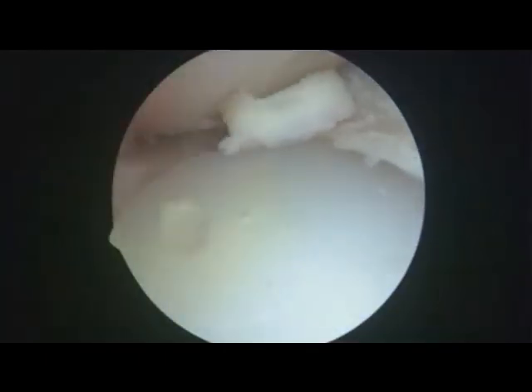There's 90 degrees of flexion. You see there's still contact with the implant, and then past 90 degrees, the posterior femoral condyle comes into play. But you see the meniscus and everything roll forward, with the meniscus and everything left in place. So I would clean up all this debris now, and I think you get the idea of how that implant's in place.